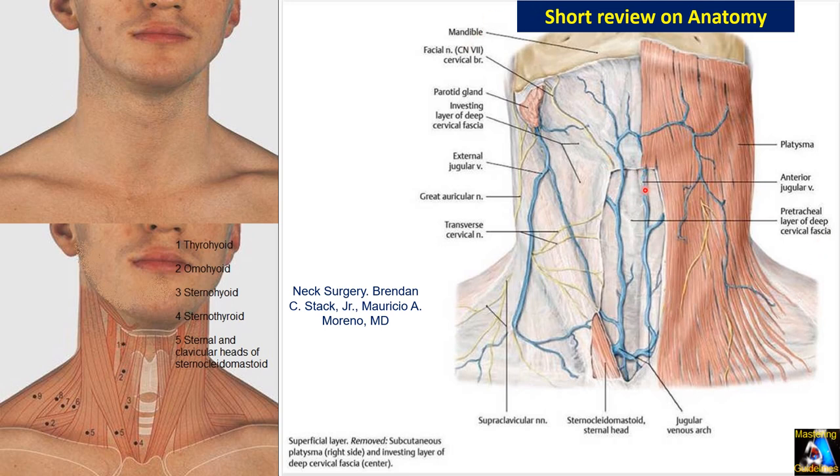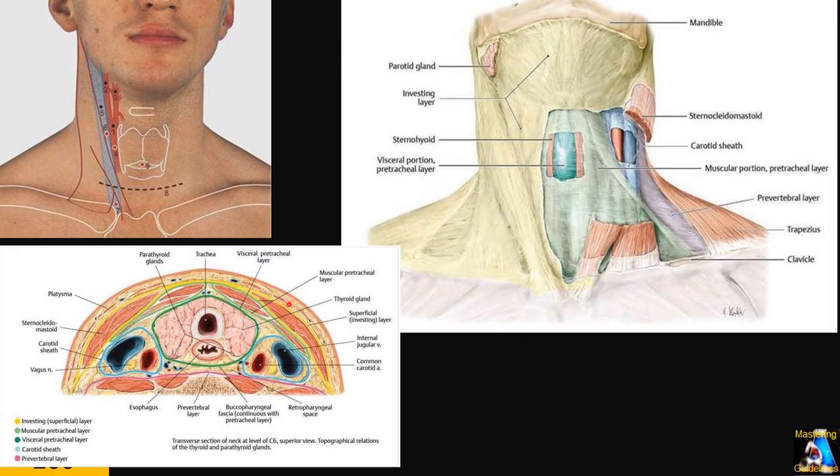Here you can see structures you may see a lot in the image. Under the skin, the cross-sectional surface of the platysma is millimeter thickness. You don't really see it — just a hyperechoic line with the deep fascia. The only thing you may see is the external jugular going over the sternocleidomastoid, but when you put the probe they collapse. You don't see it too much unless you put a pack of gel and lift the probe — then maybe you see it.